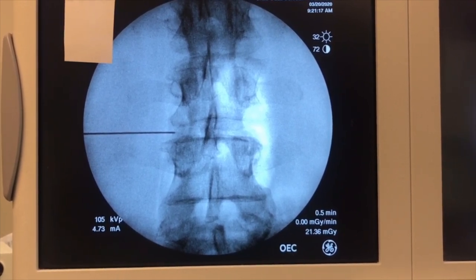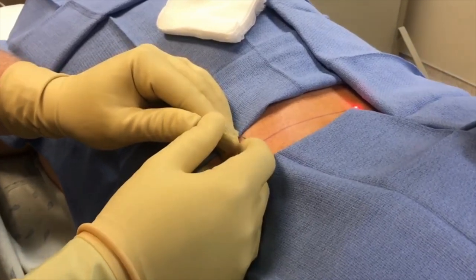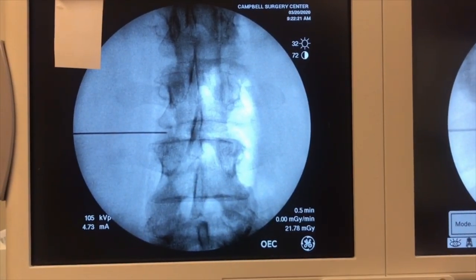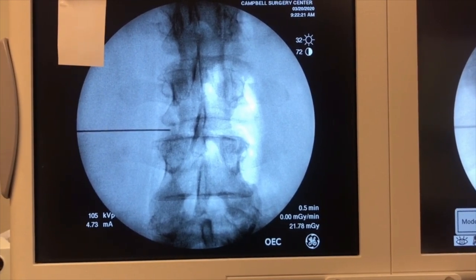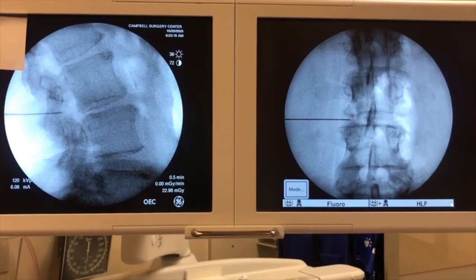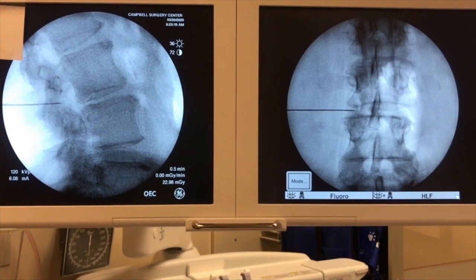I'm still safe because I'm very far from the medial pedicle line. You never want to go medial to the medial pedicle line without checking your lateral, but since we're far enough away I can advance a little bit. I get some feedback — resistance from skiving bone and pushing through the facet capsule, which is very thick and fibrous. I'm now about to the midpoint of the foramen on AP. Checking the lateral, the tip of the needle is at the pars, about where the articular surface of the L4 superior articular process is.